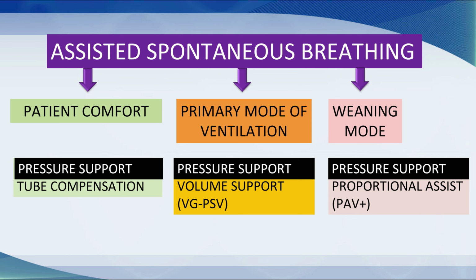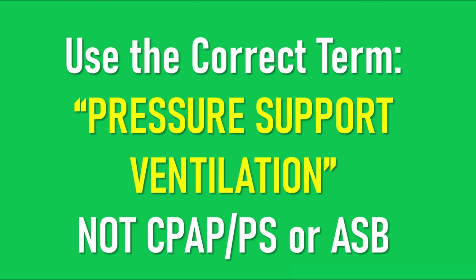It's quite tricky, and it's really important if you're using this a lot in the ICU that you understand the nuance. Another thing I really want to get through is that please use the correct term here and respect the mode. It is a very widely used mode of ventilation. The term to use is pressure support ventilation. Please do not say CPAP plus pressure support, as frankly that is a little bit ridiculous.